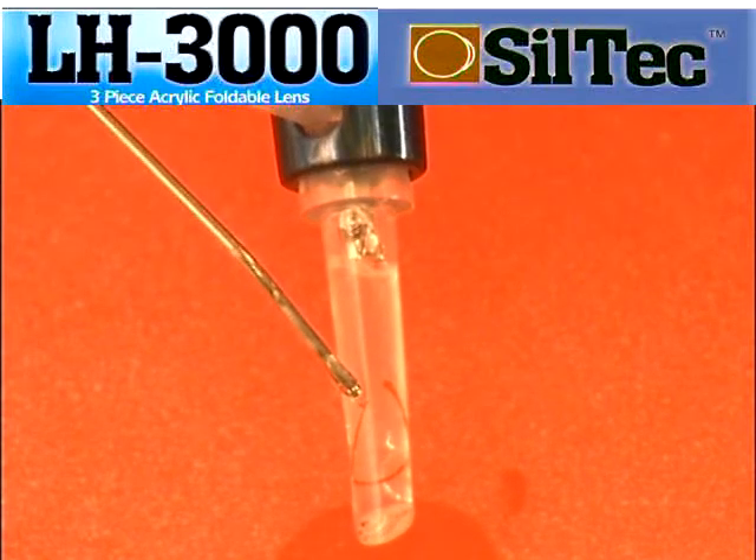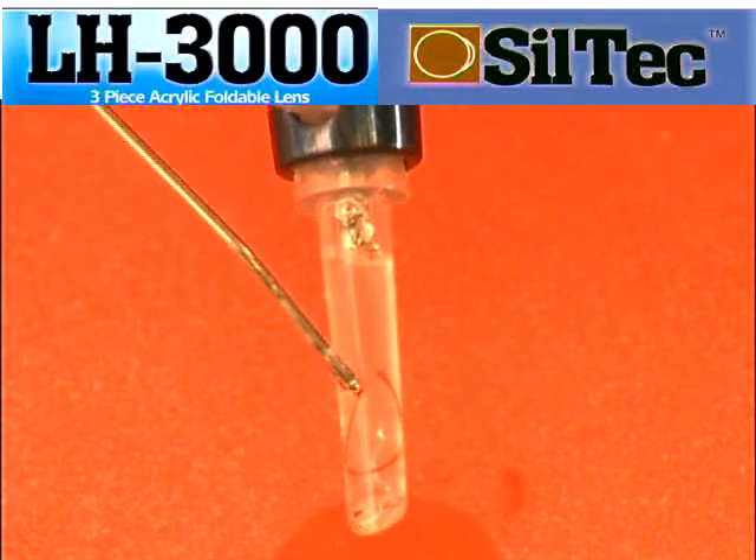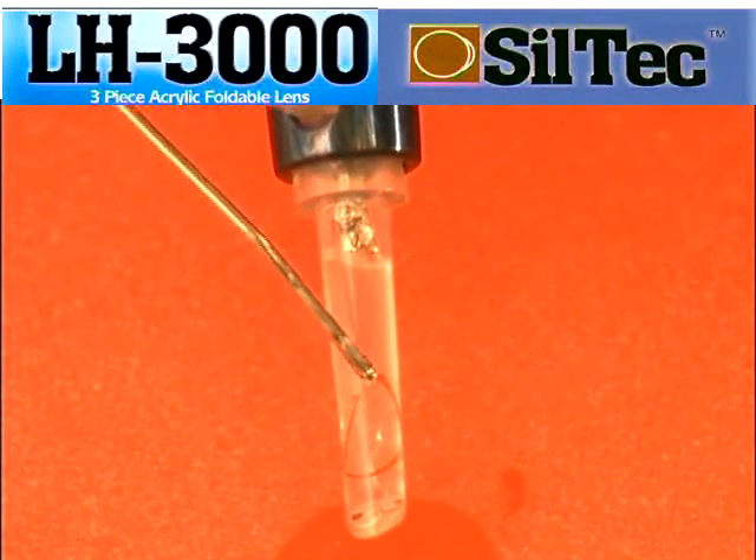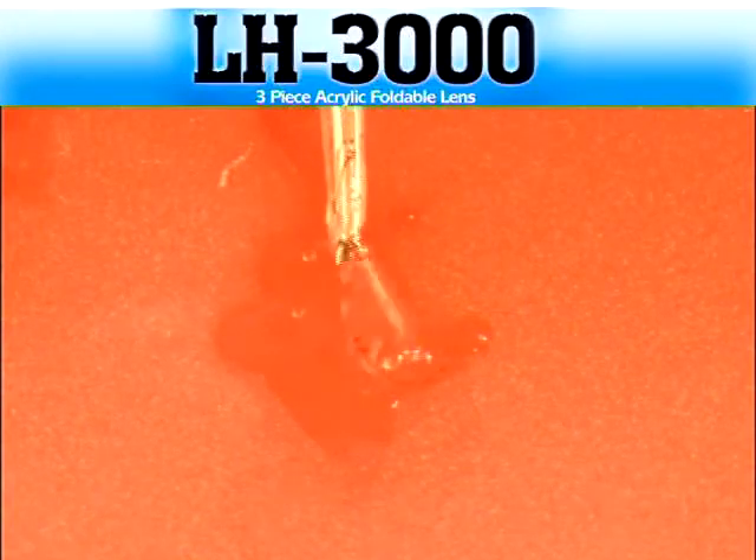Once you are happy with the position of the lens, you can begin to inject by making sure that the front haptic junction is slightly to the right hand side of the barrel. If everything is correct, then you shouldn't need to twist the injector in the eye.